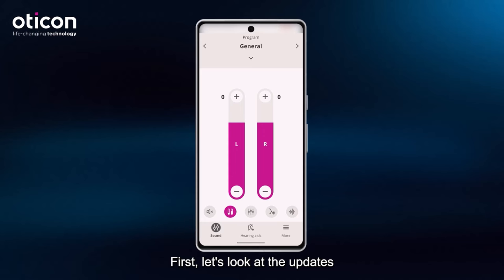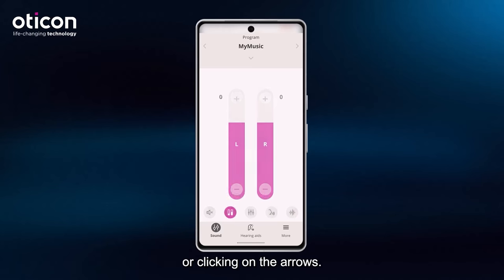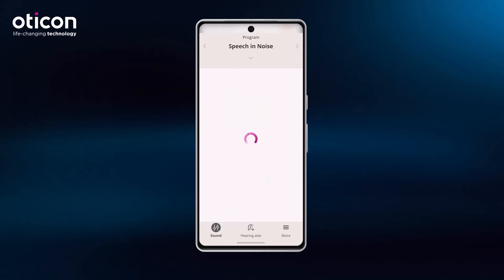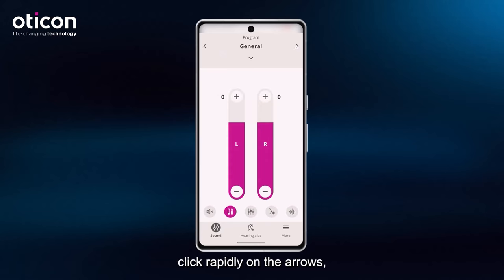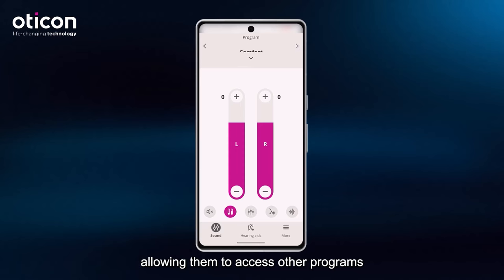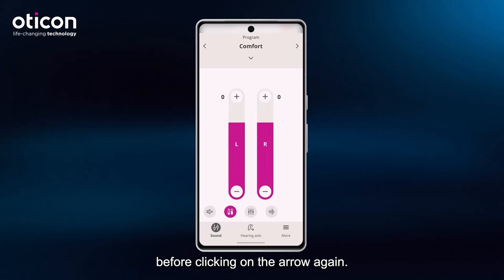First, let's look at the updates to the program selector. The program selector now allows the user to change program by either swiping or clicking on the arrows. Also, the user can now click rapidly on the arrows, allowing them to access other programs without waiting for each program to load before clicking on the arrow again.